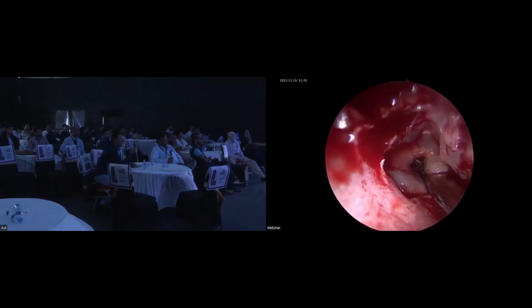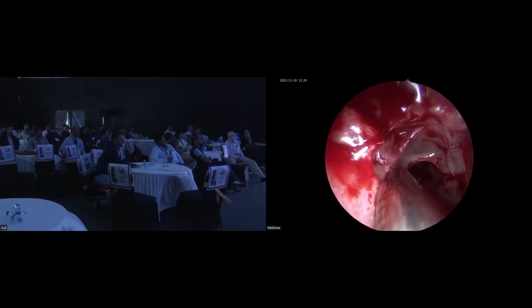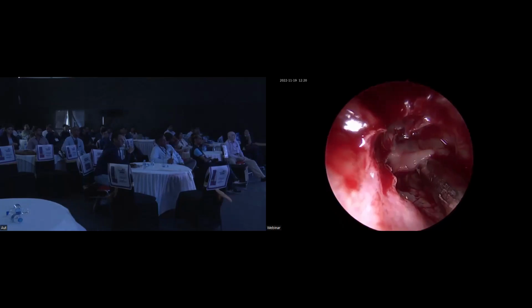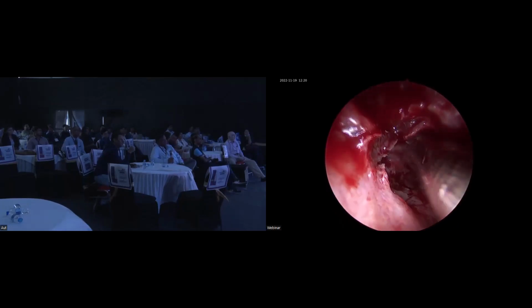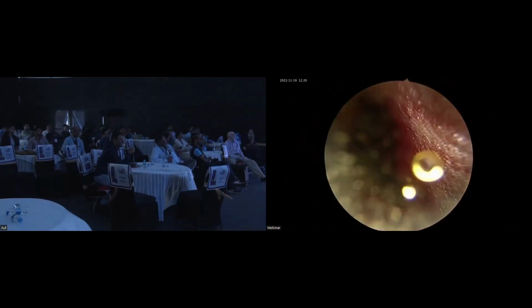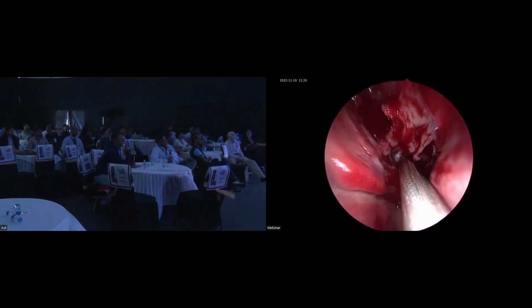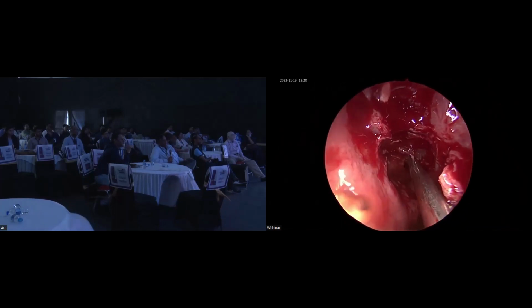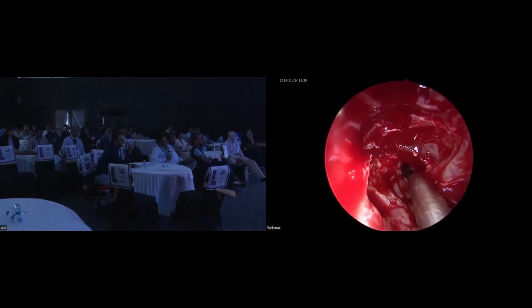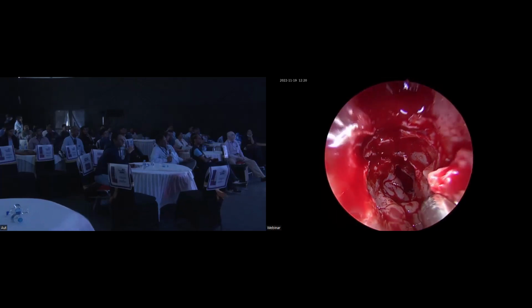The disease has already traversed to the posterior ethmoid. So presence of infection doesn't allow you to get a very good feel. You can see here that the entire mucosa is bleeding. You can see the superficial fungus coming out in the suction.